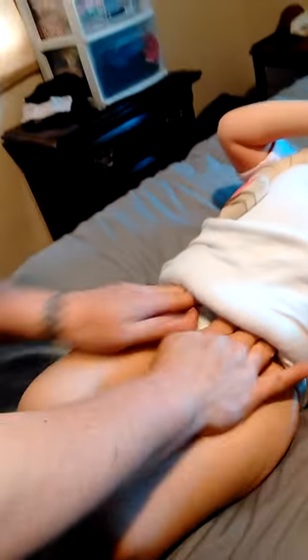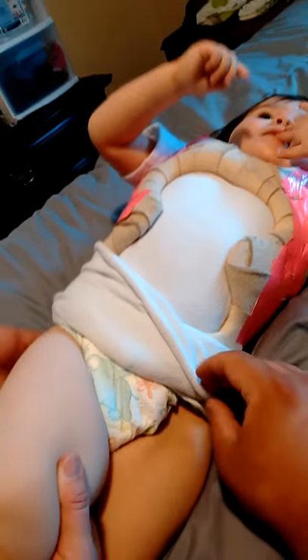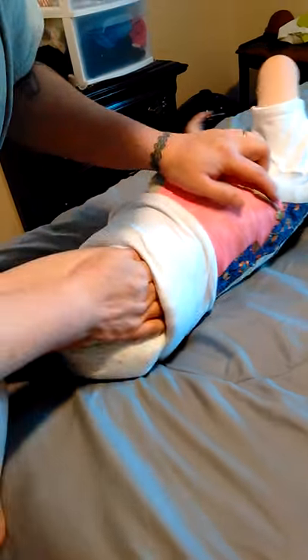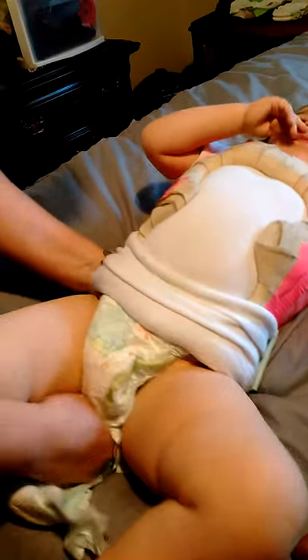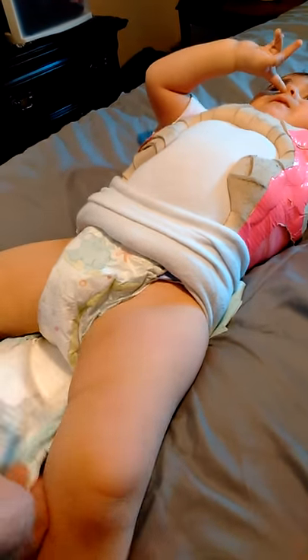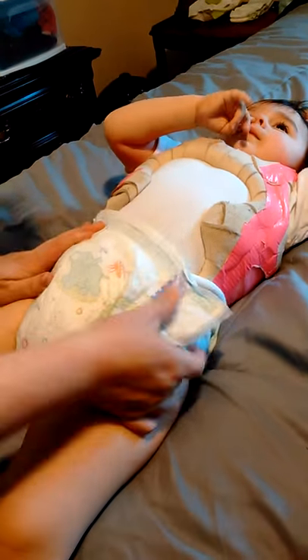Normally we don't pull this much of the shirt up — the material is usually about half of that. But leaving the diaper on and pulling it through, we got a little more shirt out. She's also getting this whole cast off tomorrow morning. It's super scary at first but it gets easier with time. My wife's been a trooper — I'm not taking care of most of it because I have giant monster hands, and these casts are pretty tight and it's really hard to get big fingers and hands underneath.